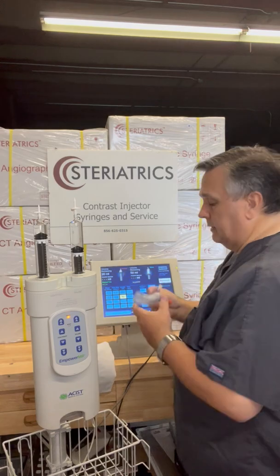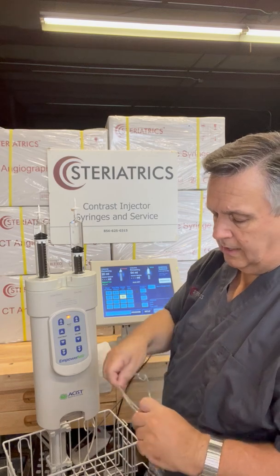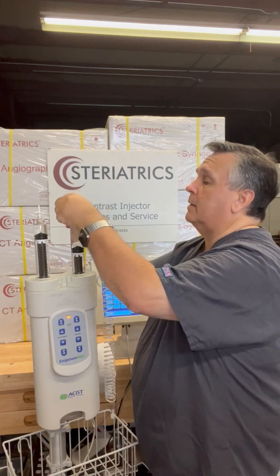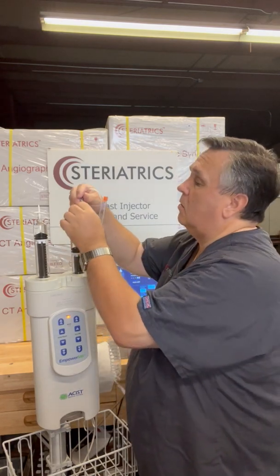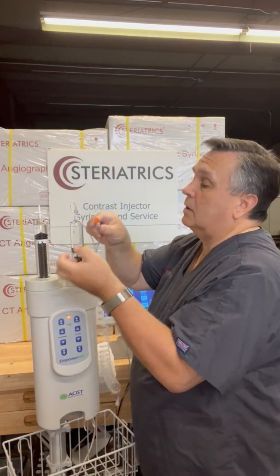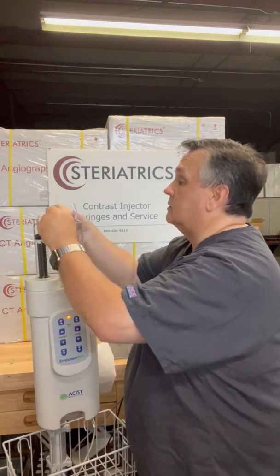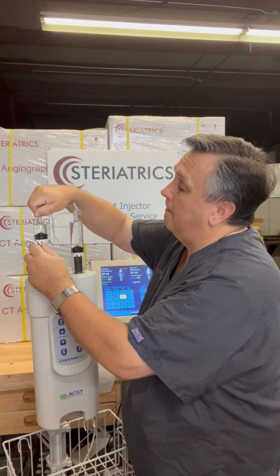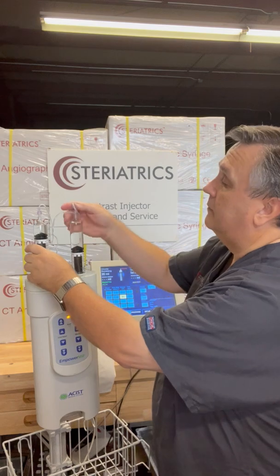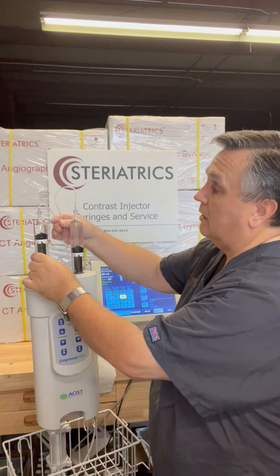Now we're going to hook up our tubing. You're going to pull the tubing — the wide side out of the center of the tubing — and take the long one. Take your spike off and throw that away. Take the long one and connect that to the saline side. The short side goes to the contrast side. Remember, we can turn these syringes to get that tension out of the line.